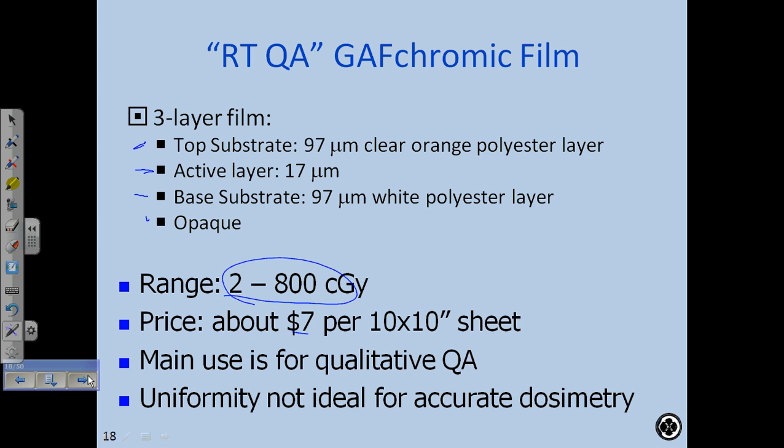Like when we did it, we just looked at it, we didn't measure it. I know, but it is sort of quantitative. I mean, it's quantitative because your tolerance is based on a protocol that sets tolerances for JAWs. Your tolerance for the JAW is 2 millimeters on a side. So your light versus radiation field coincidence should be within 2 millimeters. So it is quantitative in that respect, because if it looks like it's more than 2 millimeters, you should take a ruler and verify that. So that's the quantitative part.